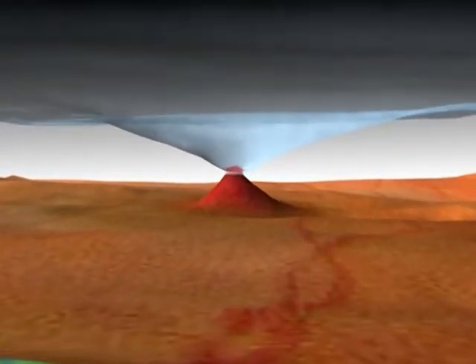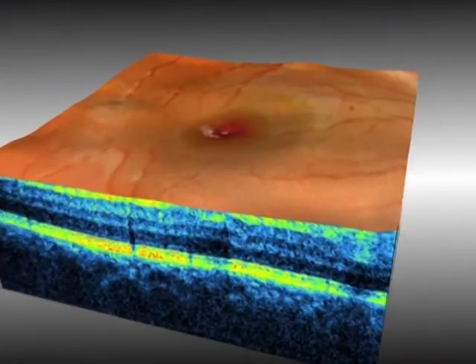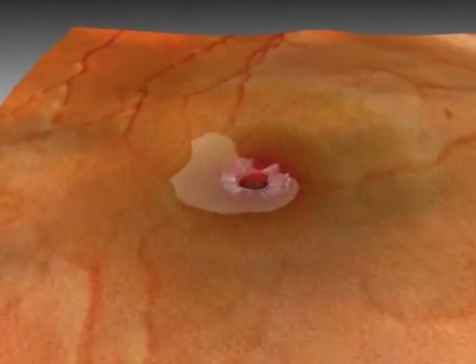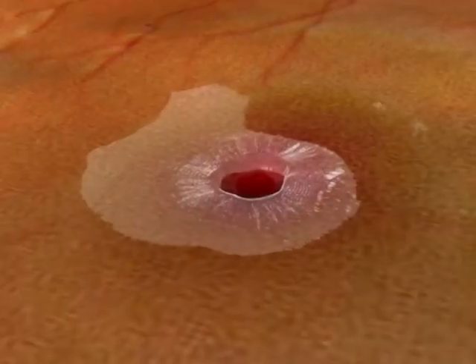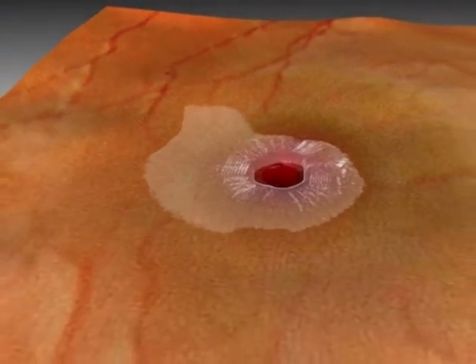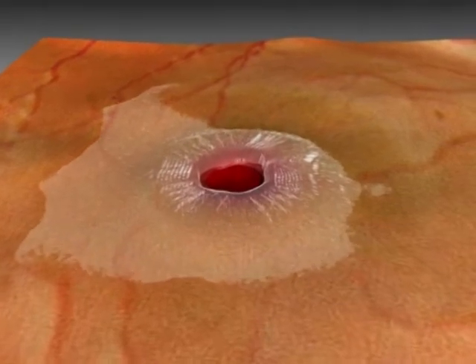Focal vitreomacular traction, focal ILM removal, creation of interretinal defect together with epiretinal membrane formation, increase of size of a non-full thickness macular hole during maturation of epiretinal membrane, which causes elevation of the macular surface.